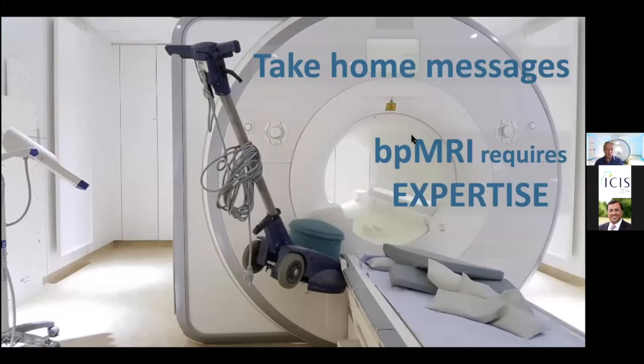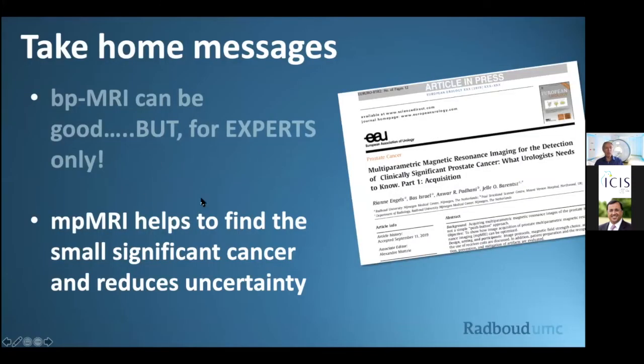Take home message: biparametric MRI requires expertise. This is very important. Multi-parametric MRI helps to find significant cancer, as you have seen in the case that I showed in this presentation. It also reduces the uncertainty.